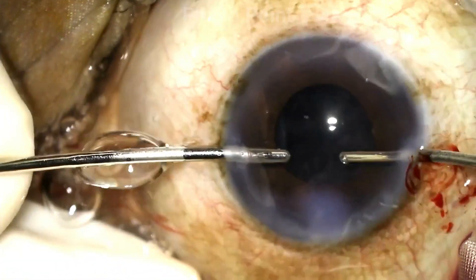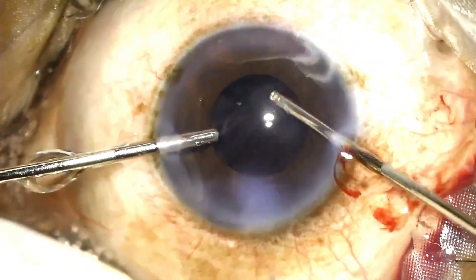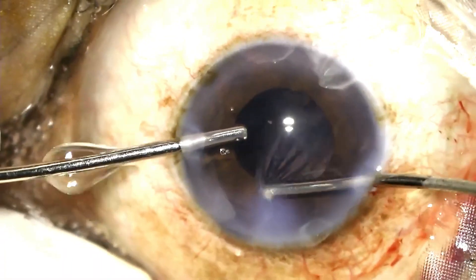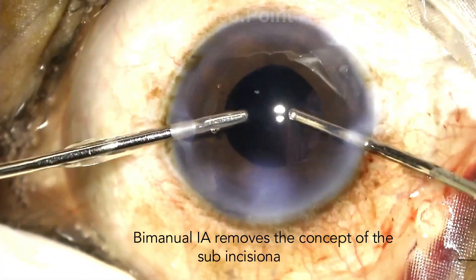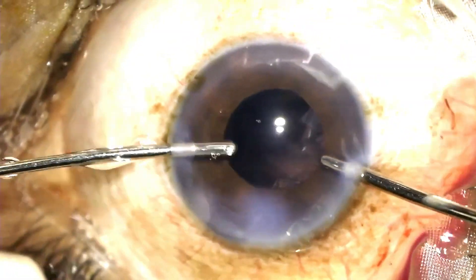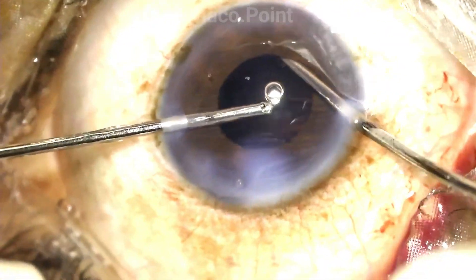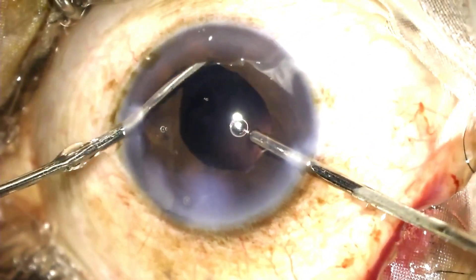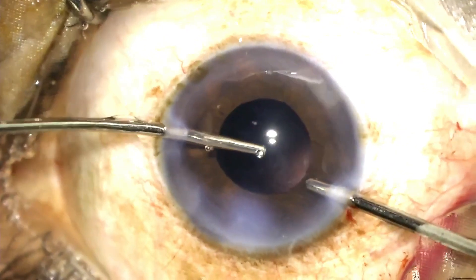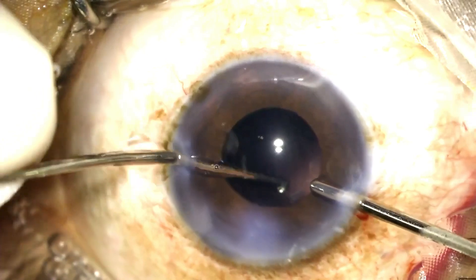The points to consider while performing the irrigation aspiration are: first, you again have limited visibility. So I prefer a bimanual irrigation aspiration because it's very easy to remove the cortex circumferentially. Another advantage of bimanual irrigation aspiration is that you can use either the irrigation or the aspiration cannula to move the iris away to aid visibility in looking for any residual cortex which may not have been removed.